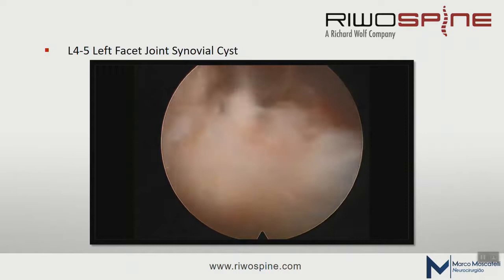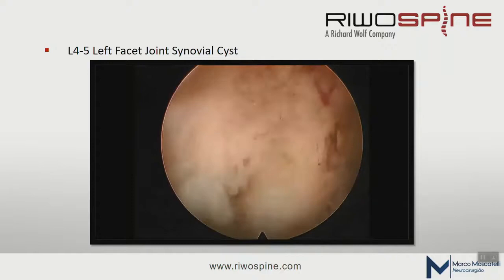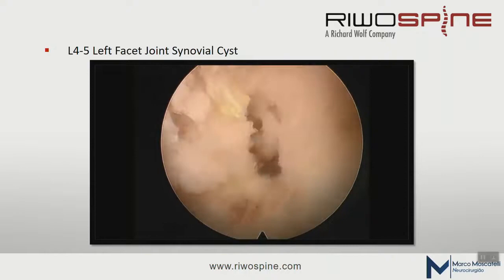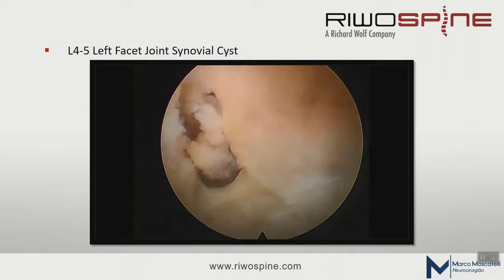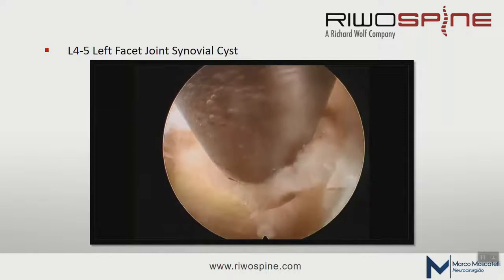Now we start the opening of the flavum ligament from medial to lateral because the epidural space is larger medially, protecting our initial opening and following the curvature of the canal. We can cut in all directions, but it's better from medial to lateral. We can use the work sleeve. And we note the neural structures below the ligaments.